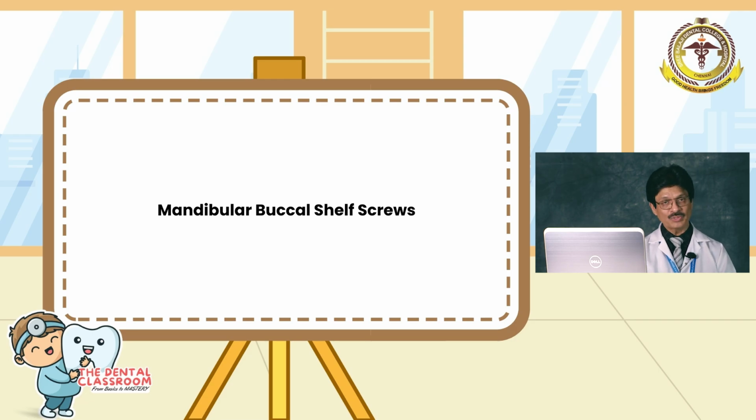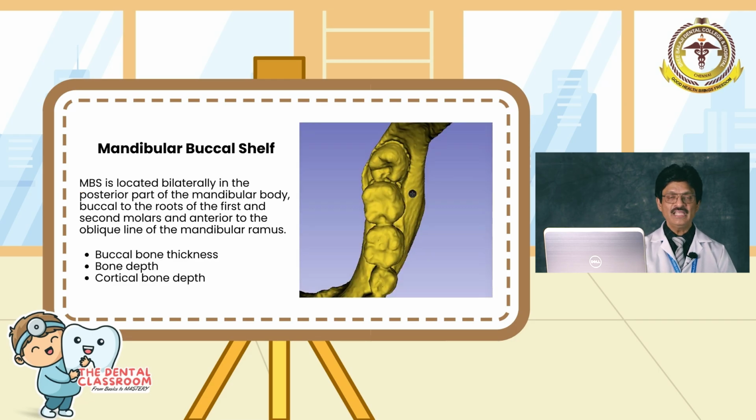Now we shall come to the mandibular buccal shelf screws. These are also extra-alveolar screws or extra-radicular screws which are placed in the mandibular buccal shelf. So now you would like to know what I mean by a mandibular buccal shelf area.